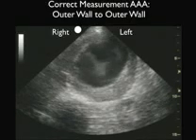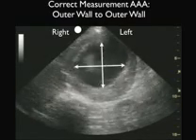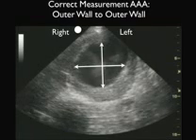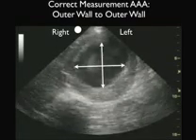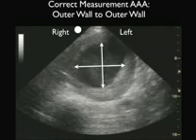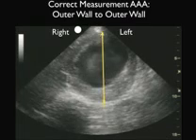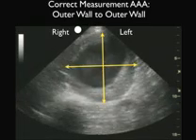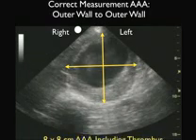This video clip emphasizes that the best measurements of the abdominal aortic lumen will be in the short axis orientation, but that we must make measurements from outer wall to outer wall. Notice this very large AAA, and we can see a large amount of thrombus coating the walls around the actual interior part of the lumen. We could vastly underestimate the true diameter of the abdominal aortic aneurysm if all we measured was the lumen towards the middle.